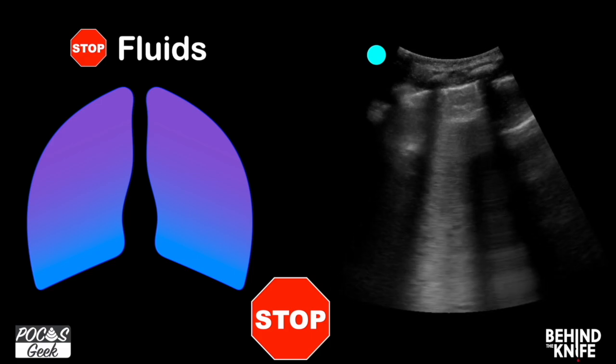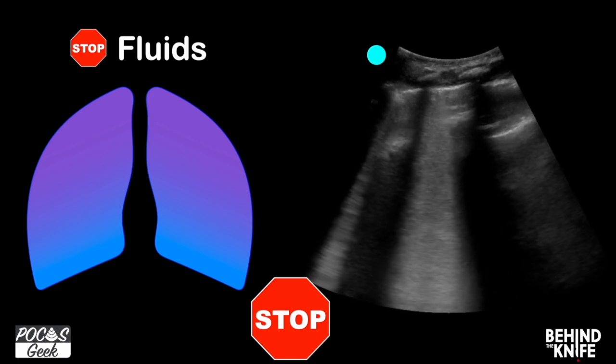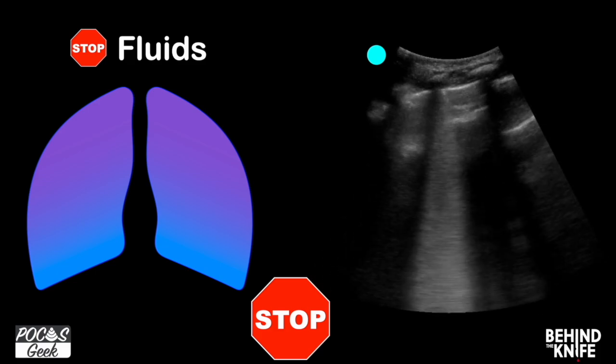This is better than a physical exam because it is objective. We can see it, assess it. And so we can use lung ultrasound to determine what effects the fluids are having on the lungs. And if they're still clear and they're improving, we can continue with fluids.